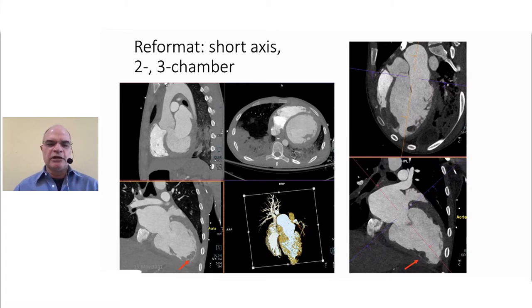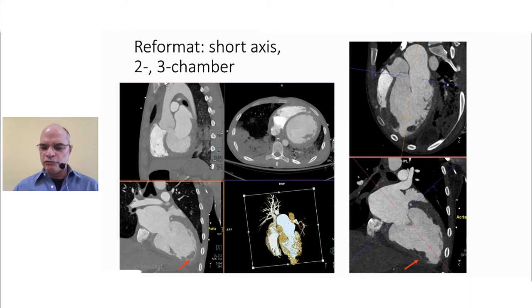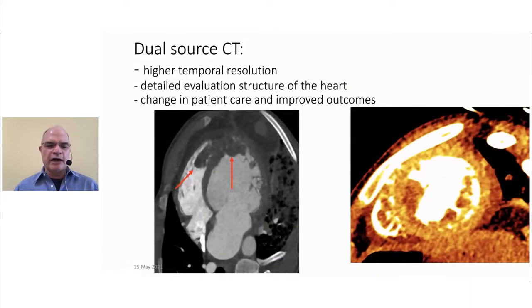As you can see on this, in the transaxial view, the left ventricle was dilated. You can notice there is some soft tissue in the apex of the heart. Since every CT is a cardiac CT, it's very helpful to go into the cardiac planes. As you can see on the upper right in a three-chamber view, and then in a two-chamber view, we're able to identify thrombi present not only in the left ventricle apex, but also in the right ventricle.